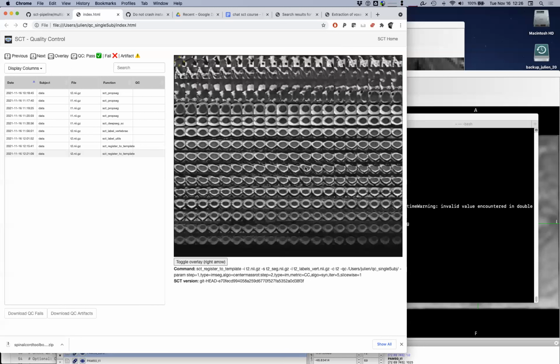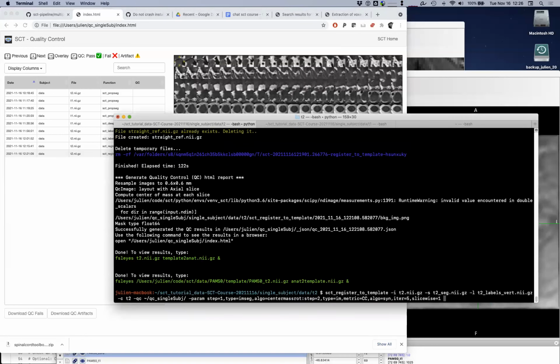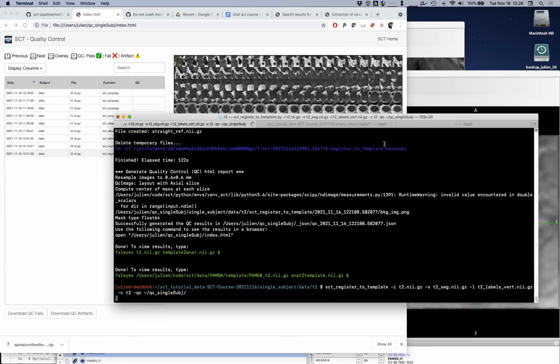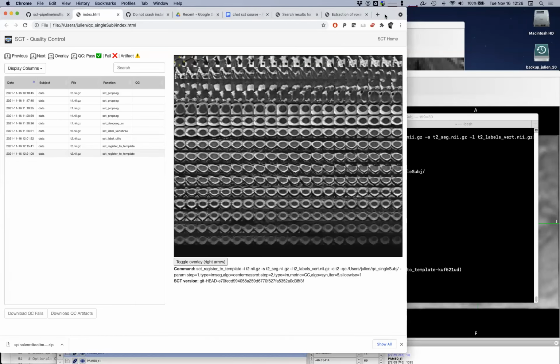If you're looking at all the slices, then differences might be averaged out. Right. I guess I misspoke when I said results. I was talking about the results of the registration. So it looks very different, right? The one we use with the regular parameters, or your default parameters, versus the ones where we modify the parameters. I guess my question was, since the registration is so different with the modified parameters, which of these 3 major changes that we make is the one that contributes the most?